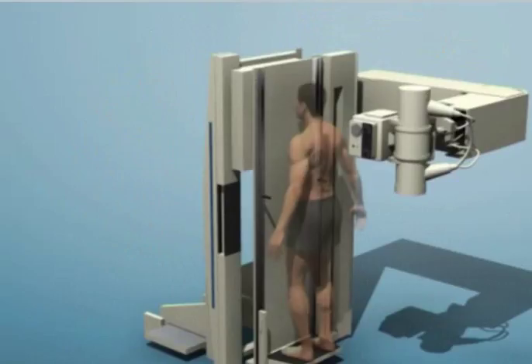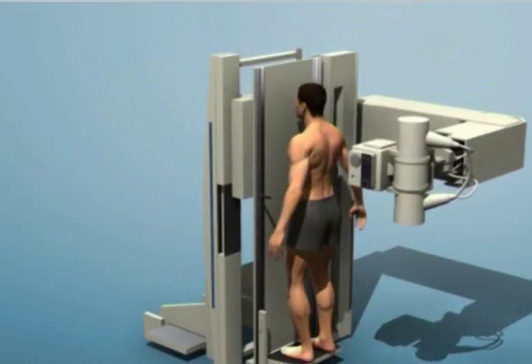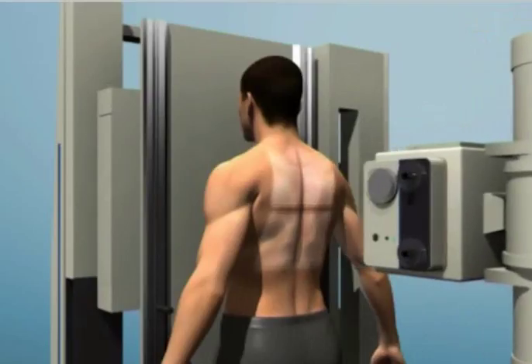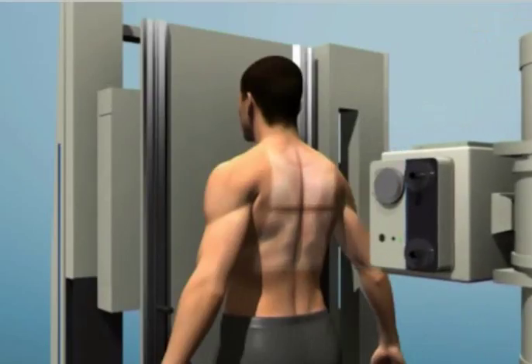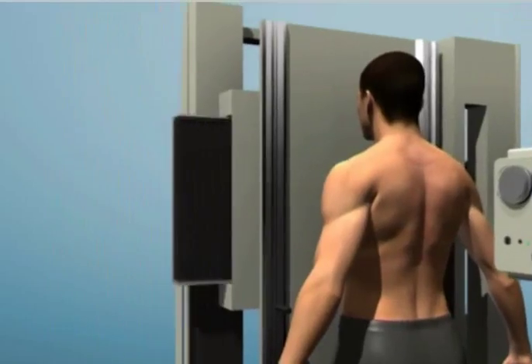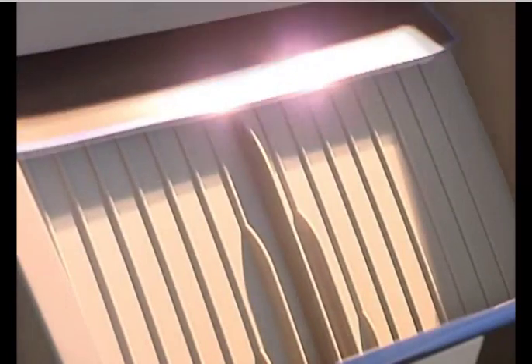The patient is standing, chest against the examination table, which is in a vertical position. The X-ray tube is placed behind the patient. It projects a marker of light that enables the correct positioning of the emitter. The patient is asked to breathe in deeply, and for about 1 second, he is X-rayed in order to make a recording on the radiographic film. The film is then removed and developed in the same manner as is a traditional roll of photographic film.